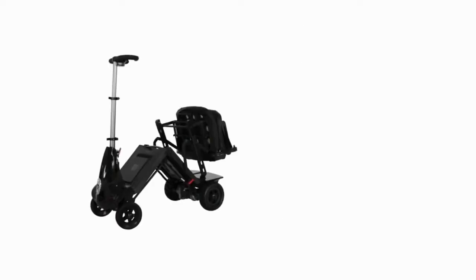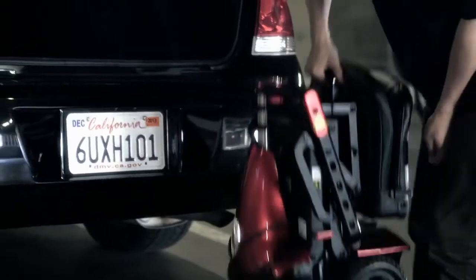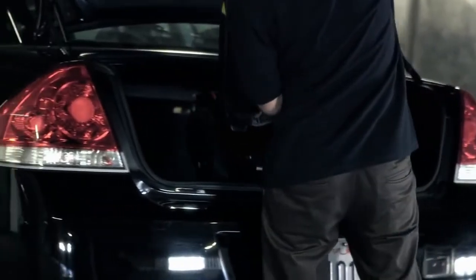I'm here to introduce you to the Solex Mobi, a compact, lightweight, foldable scooter designed to enhance your mobility. The space-saving design of the Mobi enables you to easily transport it in a car, in a train, in a plane, or even a boat.